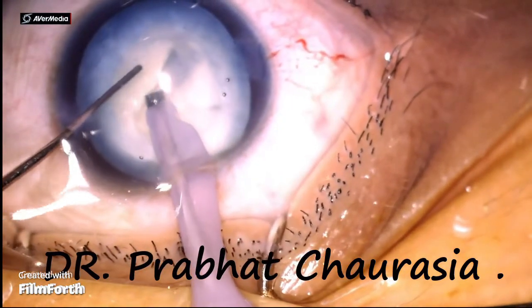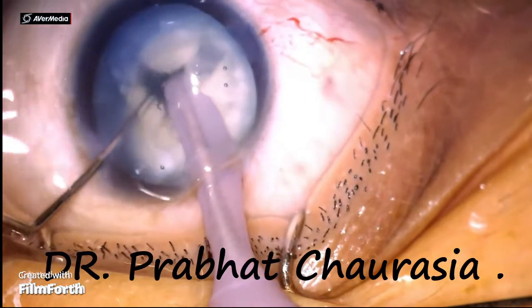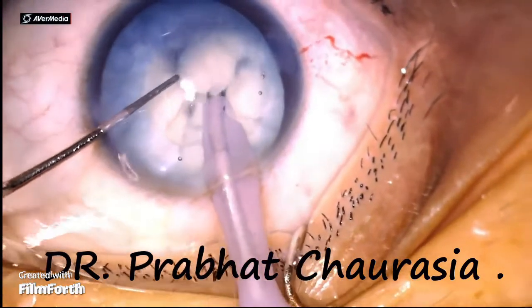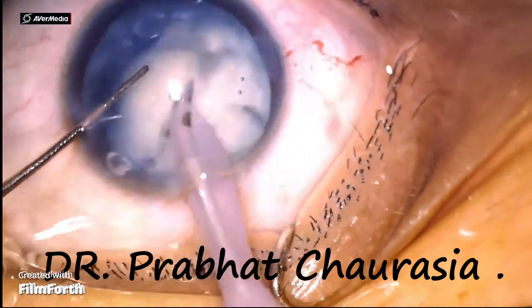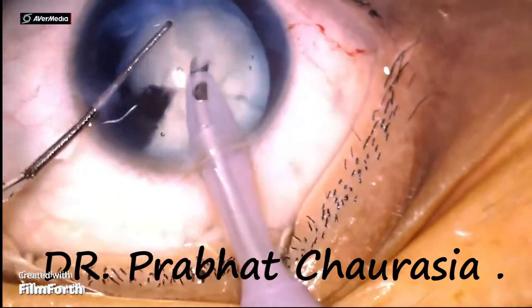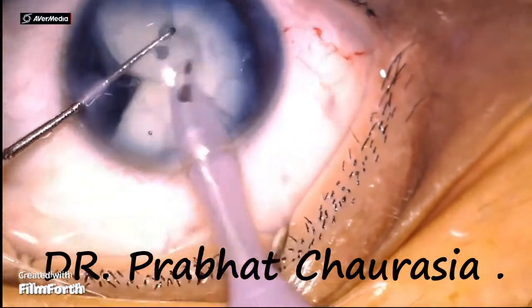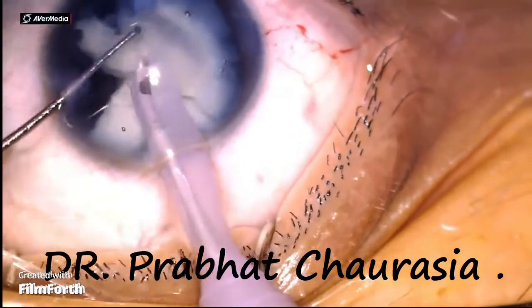Now go to US3 mode and emulsify every nuclear piece one by one. At this time, phaco energy is 60, phaco power is 60, flow rate is 70, and vacuum is 350.